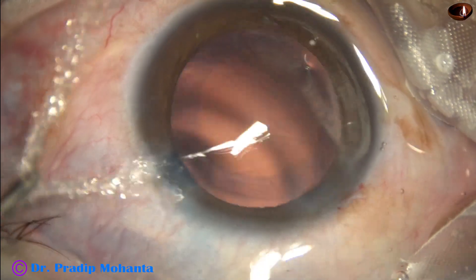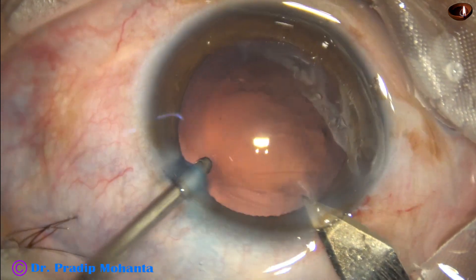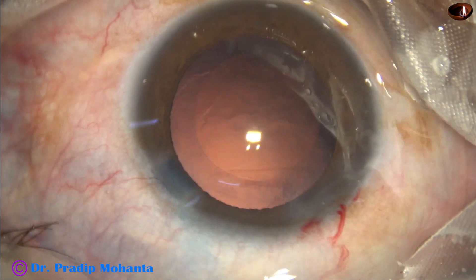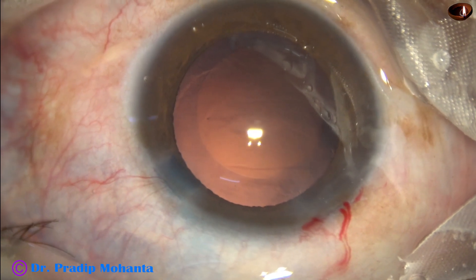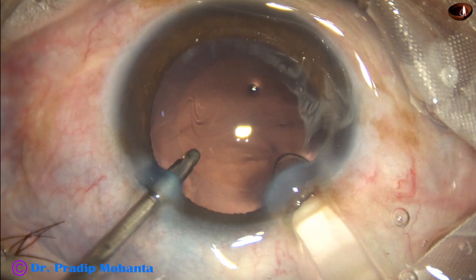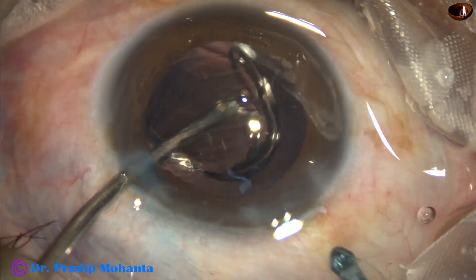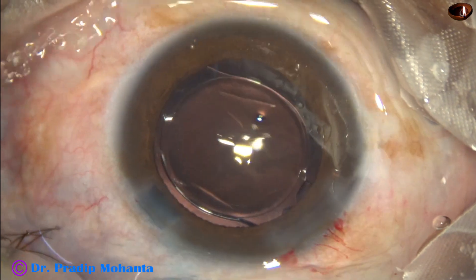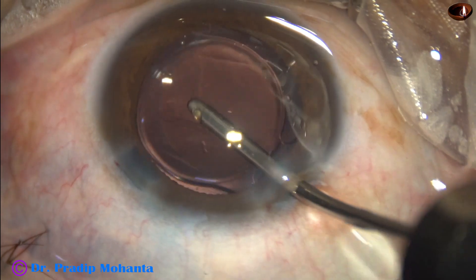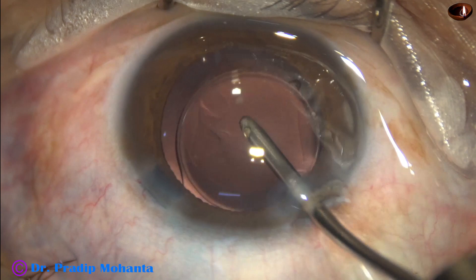Hydro-implantation of a lens is to be done. The main incision is enlarged by 0.2 millimeters, making the wound size 3. With the help of a B cartridge, a single-piece monofocal intraocular lens goes into the capsular bag. And it is done.